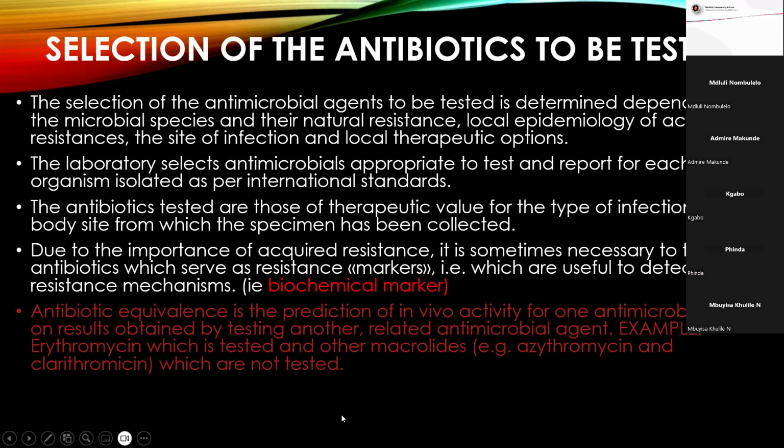As I indicated earlier on, sometimes test methods are just done to check whether identification is correct or not. So it can be used as a biochemical marker, to say ampicillin or amoxicillin can be used to confirm whether really it's Klebsiella.